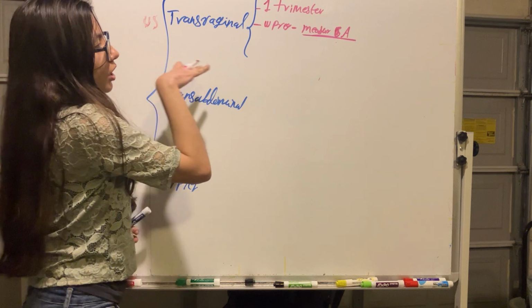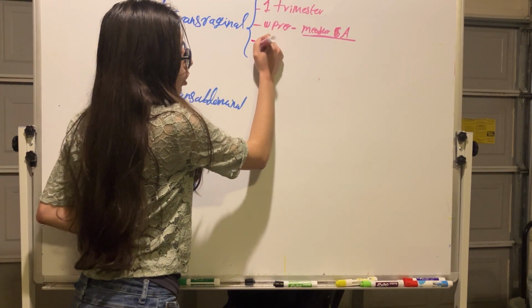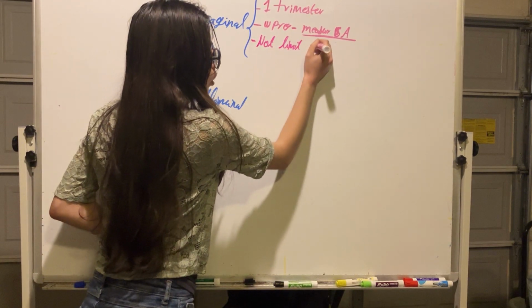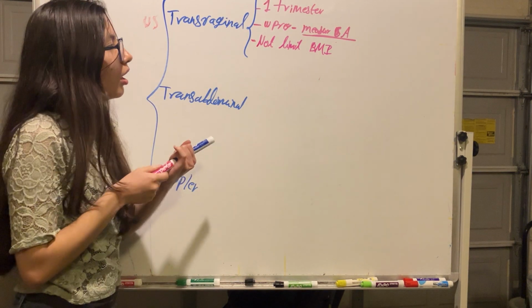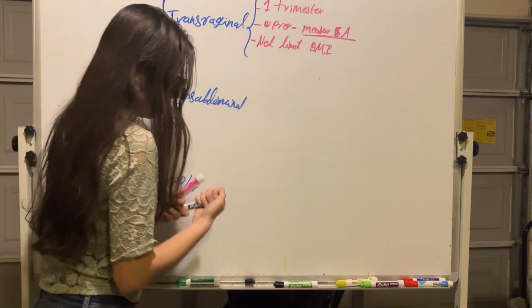The advantage of transvaginal ultrasound is that it is not limited because of the body mass index of the woman, as opposed to transabdominal ultrasound.